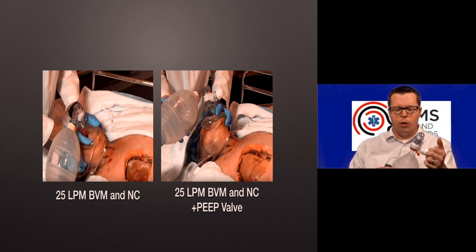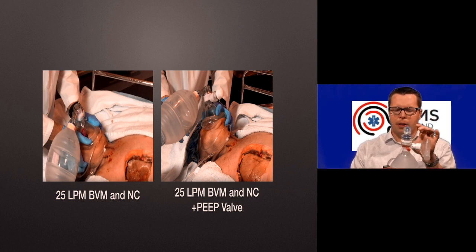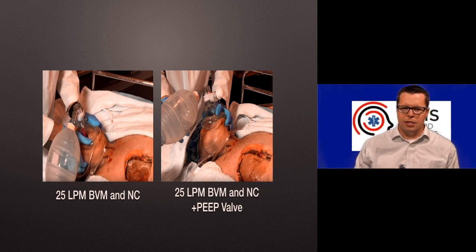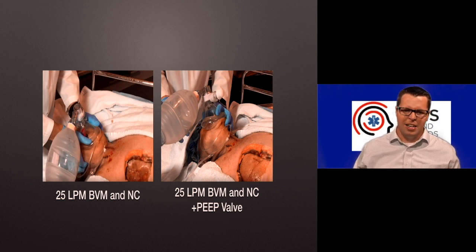of oxygen. If you don't have a constant flow of oxygen, to think that you're actually getting really effective PEEP, like you're actually getting 10 centimeters of water for PEEP just with a PEEP valve, not really the case. Add oxygen to it, and you do get pretty effective PEEP, and it stays, 8 centimeters of water, something like that. If you're set at 10, much better, much more effective PEEP, and the lung comes up a lot better and stays up a lot better.